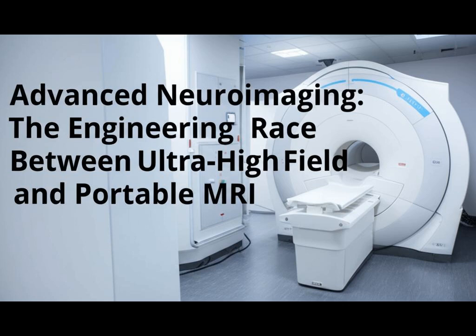Of course, there are trade-offs. The primary limitation is lower resolution compared to high-field scanners. While great for larger issues like bleeding, smaller details might be missed. Scan times might also be longer, though AI is helping speed things up.